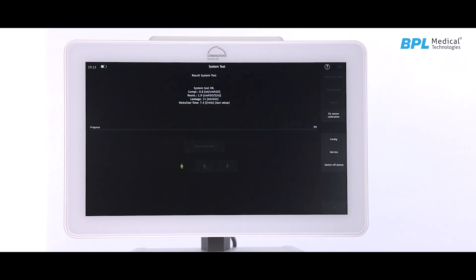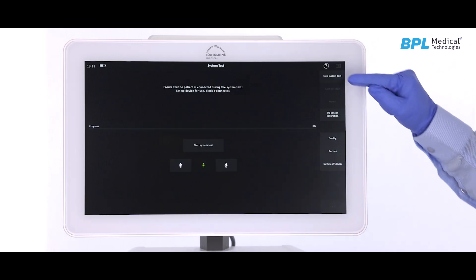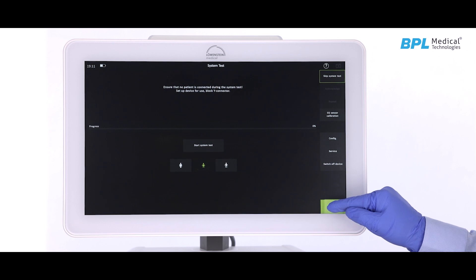At the end of each test, a confirmation of test pass with the test results will be displayed. In case of an emergency, the user can select skip test, enter standby mode and start ventilation.